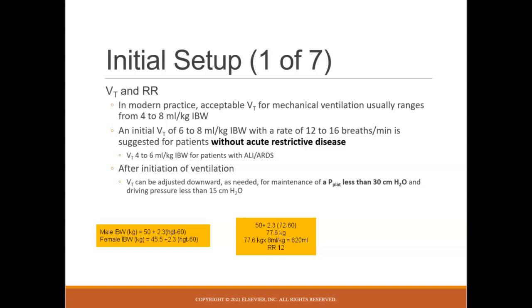It's always super important that whenever you make any vent changes whatsoever, you are reassessing your patient. Okay. I see this a lot. Probably been guilty of it before as well, where you're in a rush, you get a new setting change. The doctor says, oh, decrease the rate to 12, or, oh, increase the rate to 16. And you run in the room real quick, you turn it up to 16, and you run out and you just document respiratory rate to 16. You guys all should know by now that by changing that rate, I'm changing other things about that breath delivery to the patient. I need to take a minute and make sure that there were no negative side effects or negative impacts to the patient based on that increase in rate.